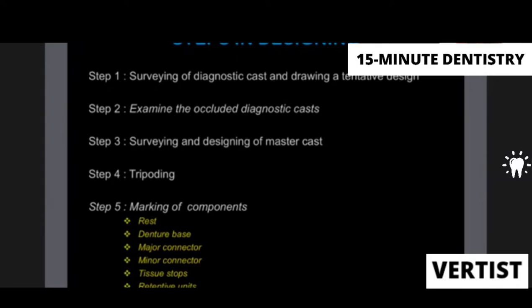Now, I'm going to be telling you a color code of what color codes are supposed to be specifically used when you're drawing your diagrams and specifically drawing your components. But let's first see what is surveying.